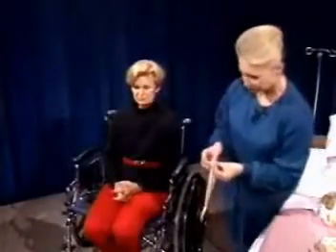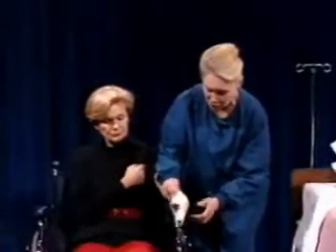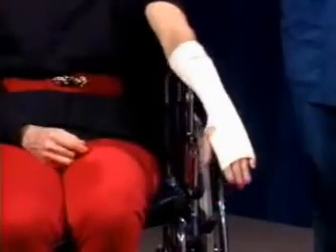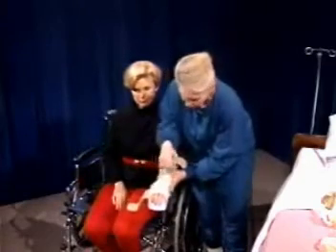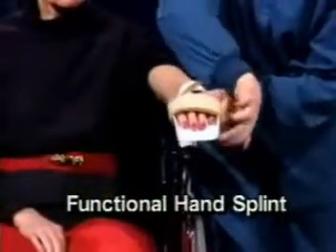Today we're going to start with looking at a functional hand splint. This is called a stockinette. It's the first piece of equipment that goes on the patient's arm. It acts as a little bit more of a cushioning element and helps decrease skin breakdown. We're going to be applying the functional hand splint, which is a rigid splint. And today I have used a prefabricated splint made by a company, but again, these can be fabricated by therapists. It supports the thumb and all of the digits and the wrist in alignment. It's used on patients that have wrist drop, and I'll show you what wrist drop looks like in a minute.